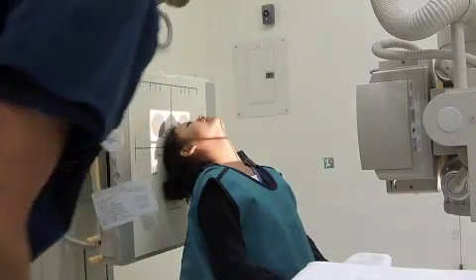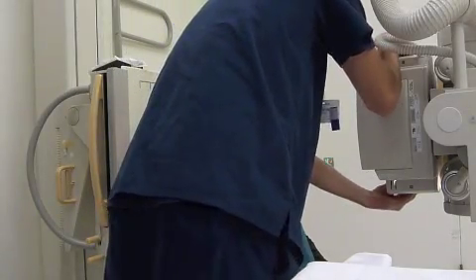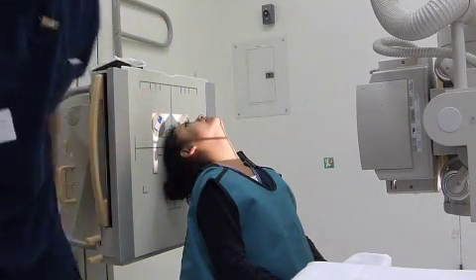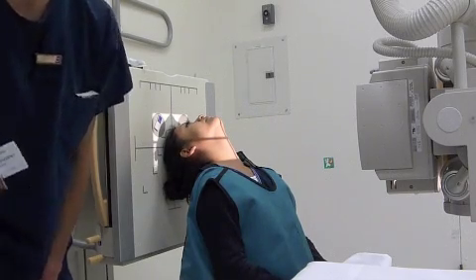Alright. There's my central ray. Cone down here. Alright. I'm going to put my marker on there. And the technique I will use will be 75 at 20 mAs. I'll now take the image.